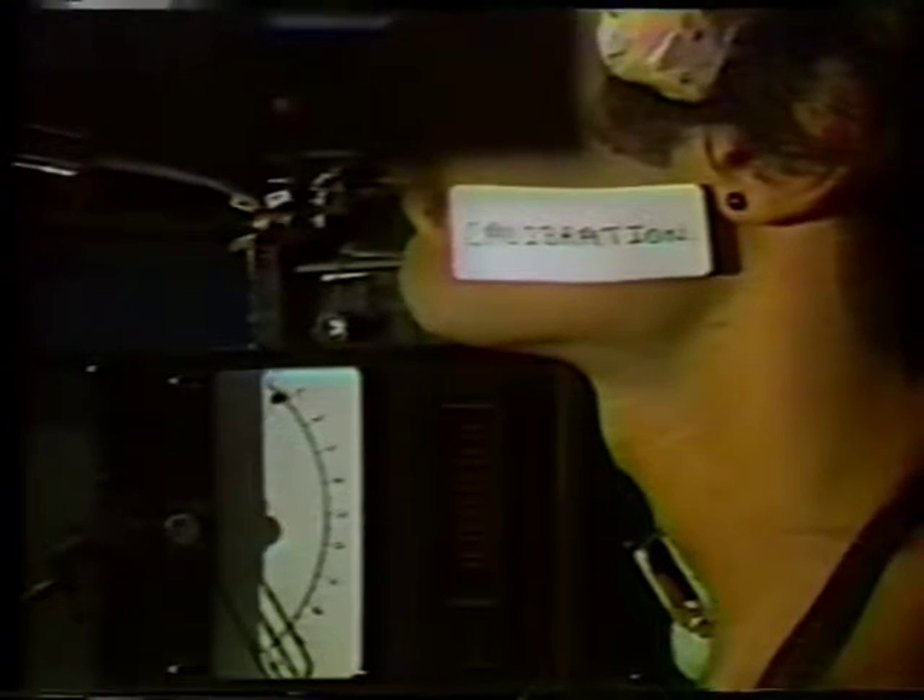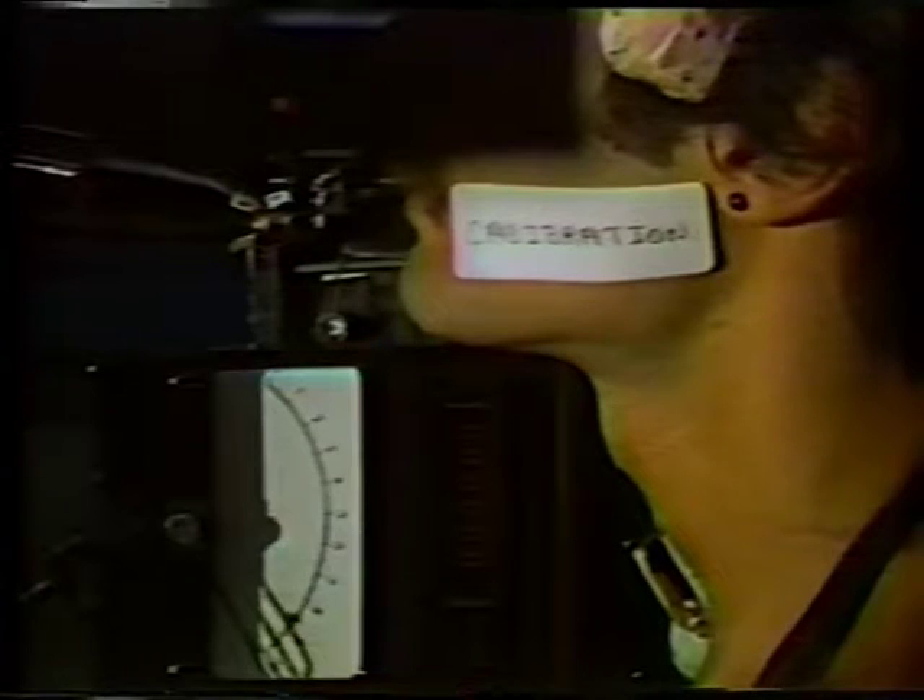Since then, 75 subjects have undergone this procedure. This technique is complex and to be done successfully requires a melding of specialized equipment, drug administration, control procedures, and a great deal of experience. The danger to the subject when the procedure is done carefully is quite minimal.